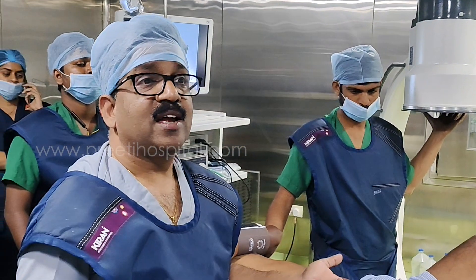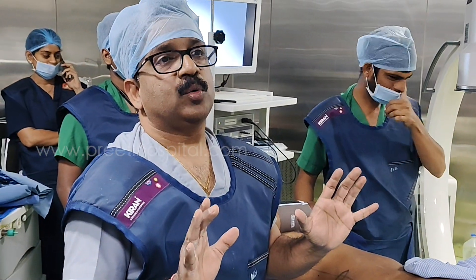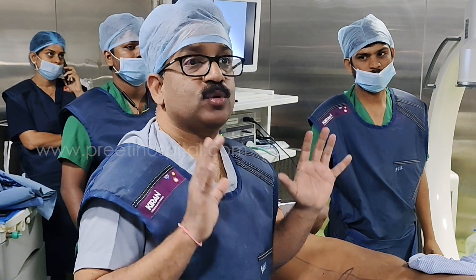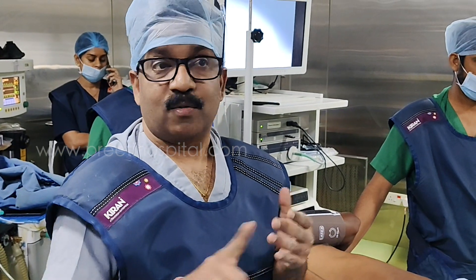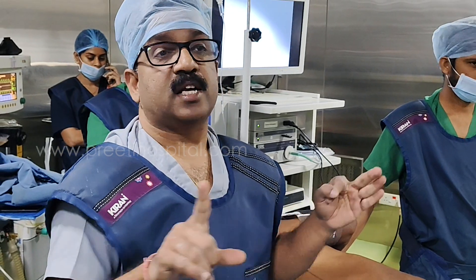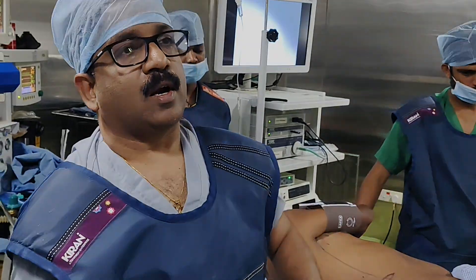Is it an easy case? Never say easy — when you say easy and go in lightly, that day the problem will come. Never say always. Never say I have never done it. Three words any surgeon should never use: 'never,' 'always,' and 'easy.' Any day can be a bad day. So now they will position the patient in camera.